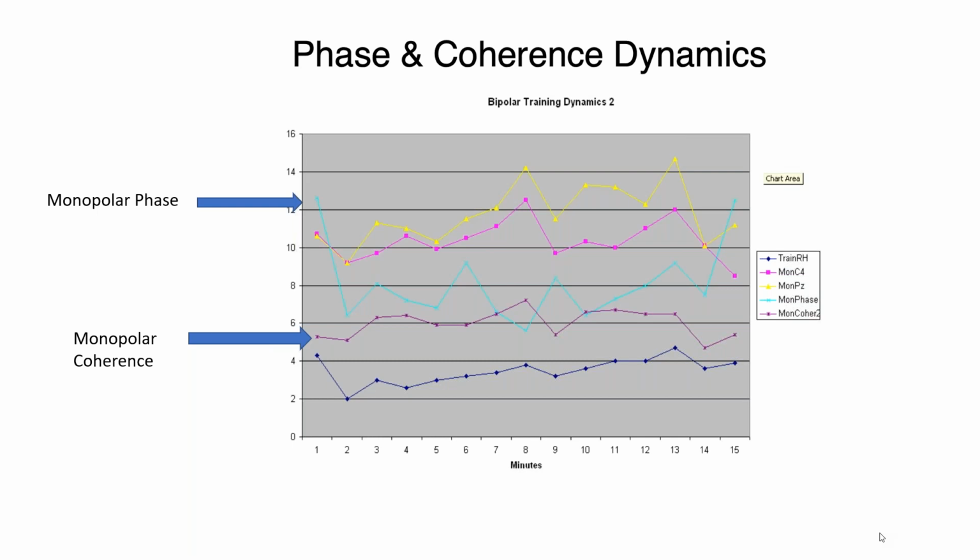Siegfried, who was using bipolar at the time, said he really wanted to switch over to 2-channel for the very reason that I said: you could track more closely what coherence, phase, and amplitude were doing. He said, it's like a black box. We don't know. If you had 2-channel, you could know. I immediately thought, he's right. He's a physicist. He's absolutely right. We really need to track this data closer if we're going to keep progressing and making improvements. So that's why we went that way.